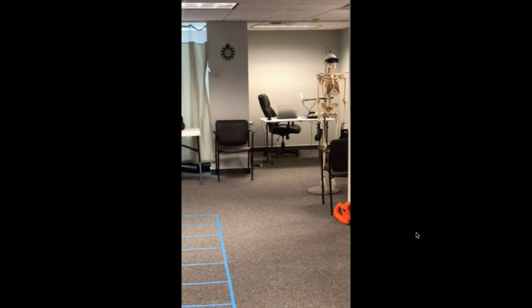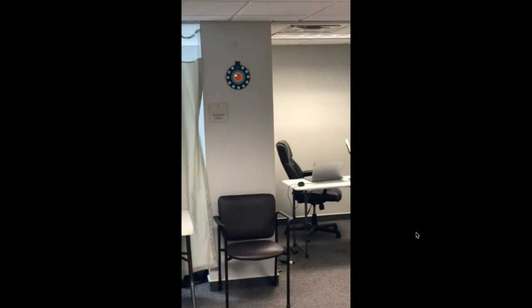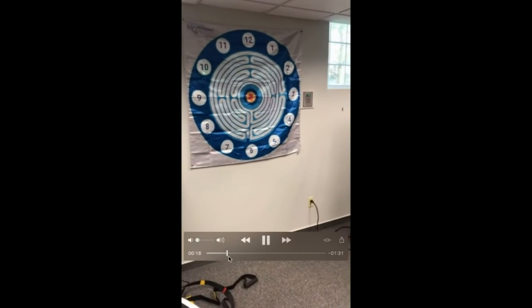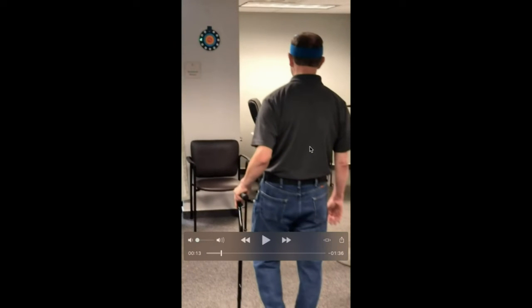He's going back and forth between two targets for some motor control applications. There's a huge postural component of as soon as they turn on the laser and they want to keep, during his walking, keep the laser on the target. Let me go back just a second. His posture, his upright posture changes. And as everybody's probably understanding on this call, that forward posture, that center of gravity change can be super important as far as predictability for falls. Mix that with a bradykinetic and a freezing posture, and that's where Parkinsonian patients really get into trouble.